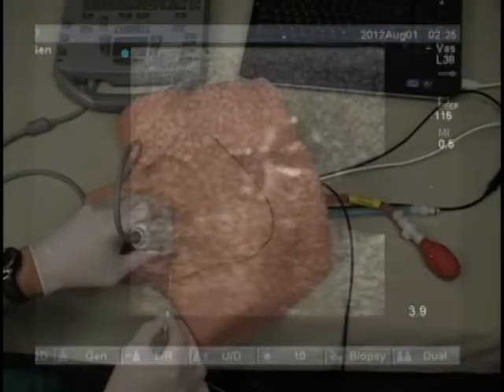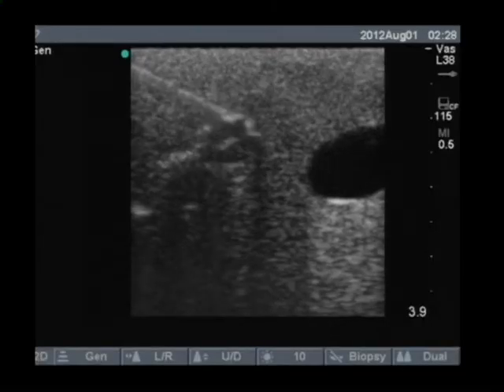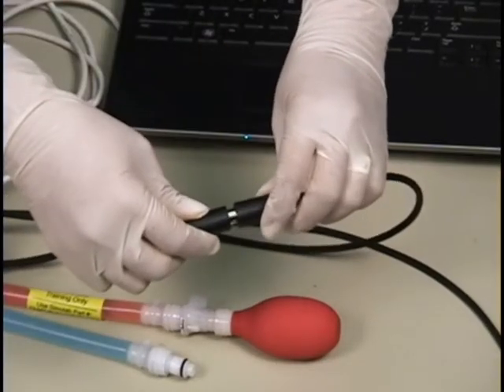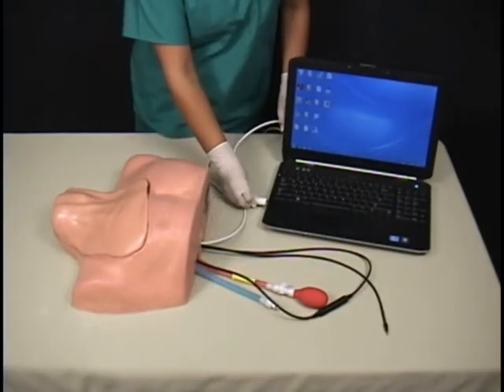During the procedure, contact with a neural sheath can be felt externally and viewed under ultrasound. The system simulates nerve stimulation using Simulab's patent-pending smart tissue, which allows the PC to interpret locational sensor data generated by the tissue.